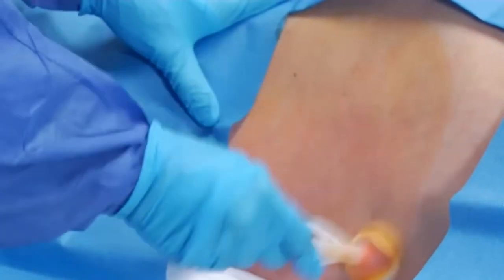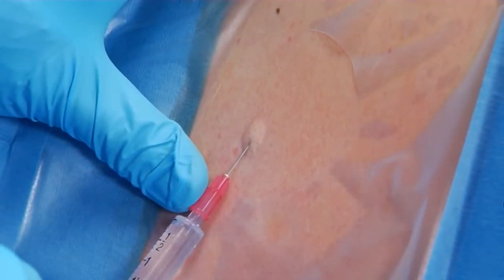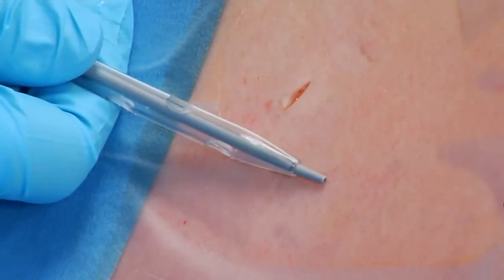Prepare the chest tube insertion site with antiseptic solution and drape in a standard fashion. A mid-axial approach is recommended. After injection of local anesthetic, make a small skin incision slightly larger than the diameter of the chest tube.